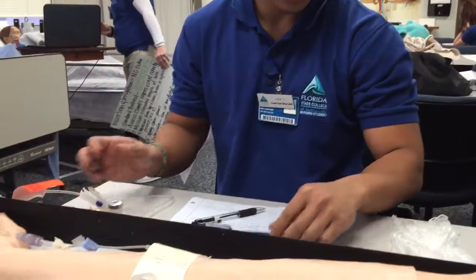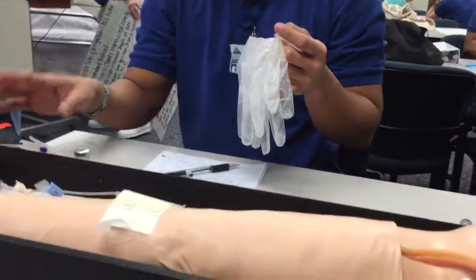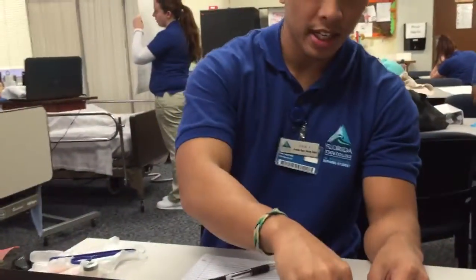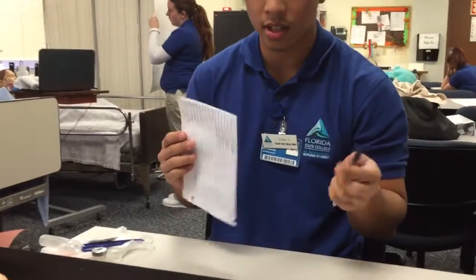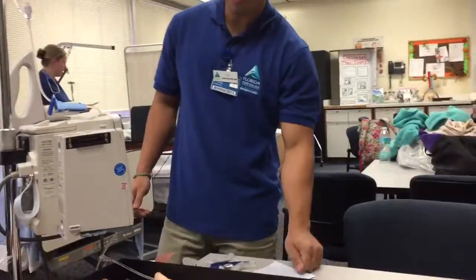And then I'm going to go ahead and gather all my supplies again. I'm going to gather my piggyback, my gloves, to hang this. I'm going to go ahead and take my alcohol swabs and my doctor's order, and I'm on to the room. So, let me go ahead and get up. I'm going to go ahead and knock on the patient's room.